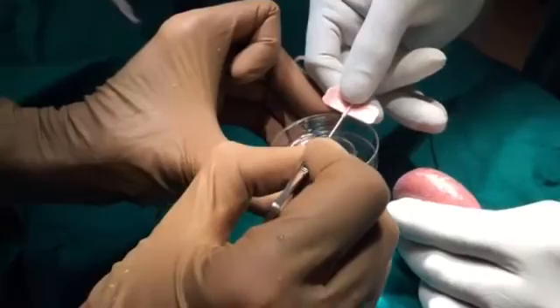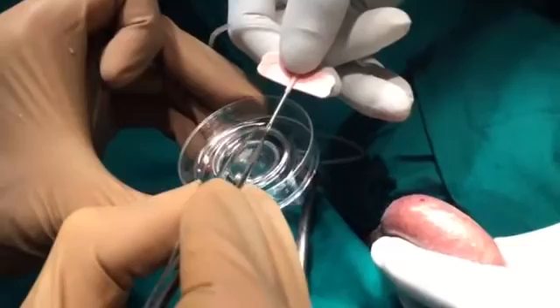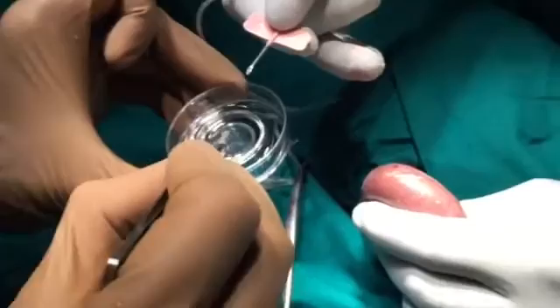This is an 18 gauge needle — a scalp vein set is what's being used. And that's how much tissue we've got, as you can see, without making a cut in the skin.